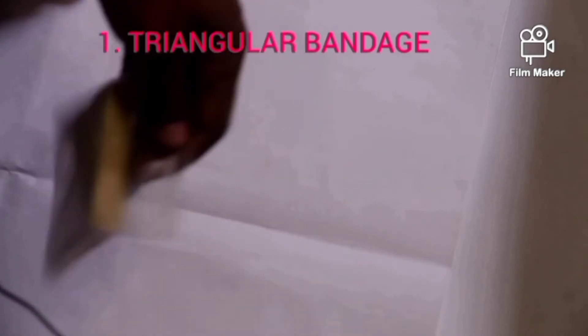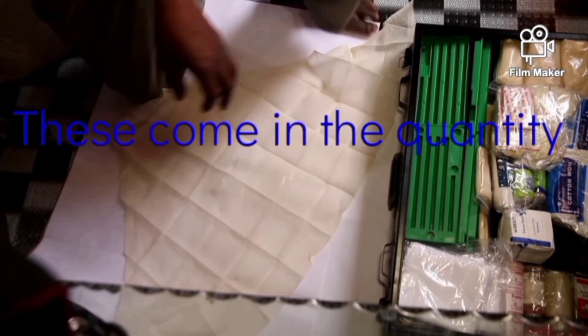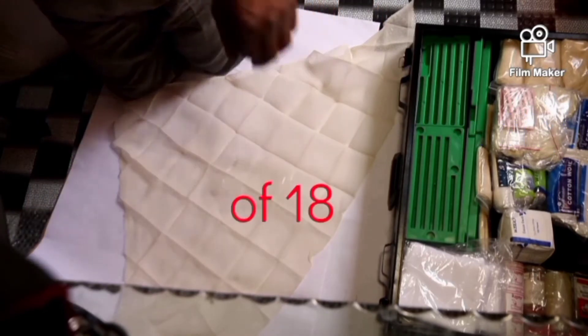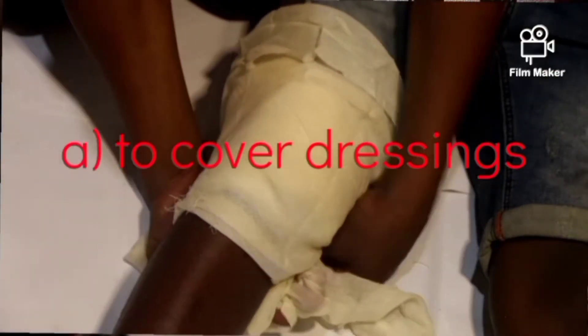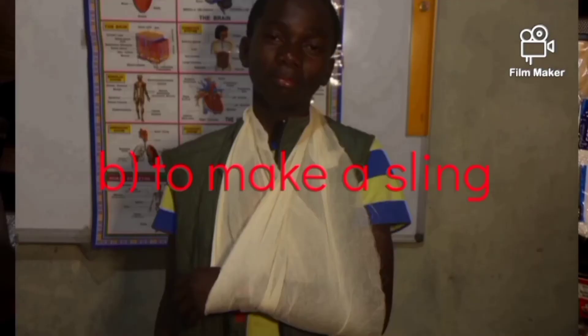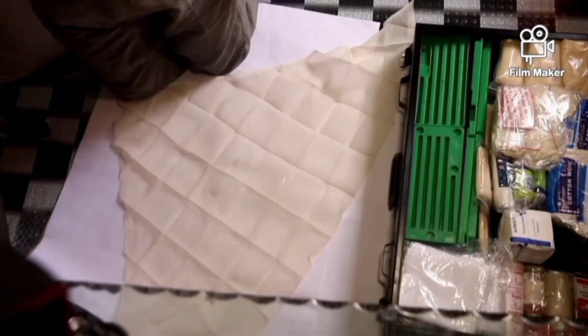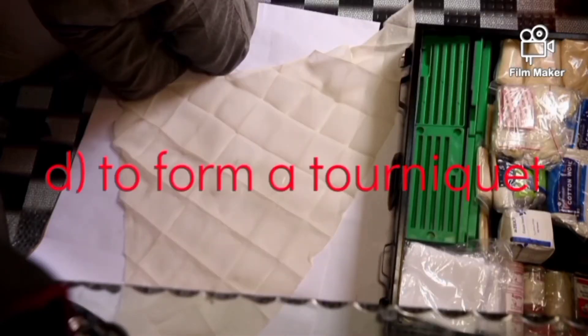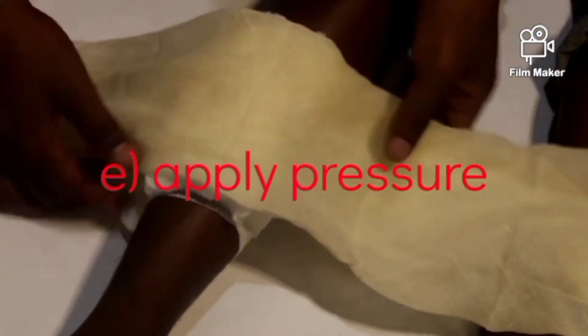This is a triangular bandage. This is in a triangular form. These come in a quantity of 18. This triangular bandage is used to cover dressings on wounds. It is to make a sling to support the arm which has been injured. It is to fix splints in case of fracture, to form a tourniquet to stop bleeding. The last use is to apply pressure over a dressing to stop bleeding — we may also call it a pressure bandage.